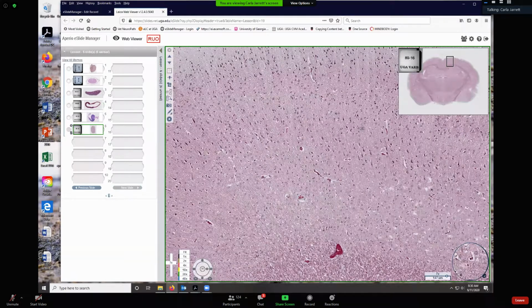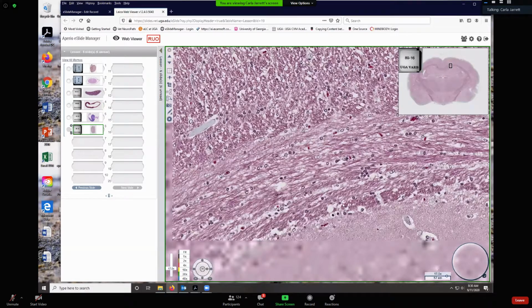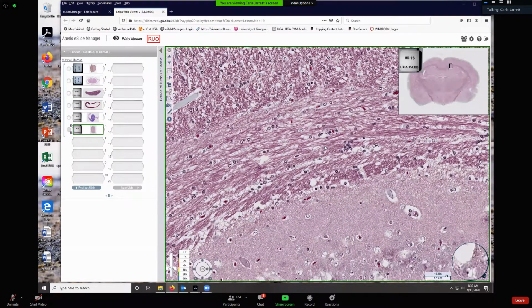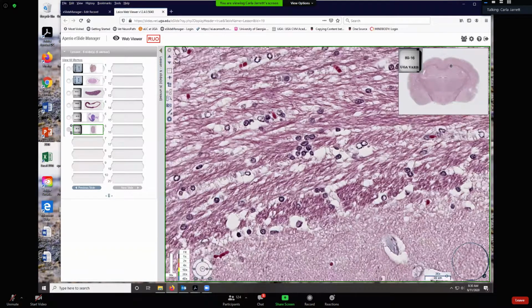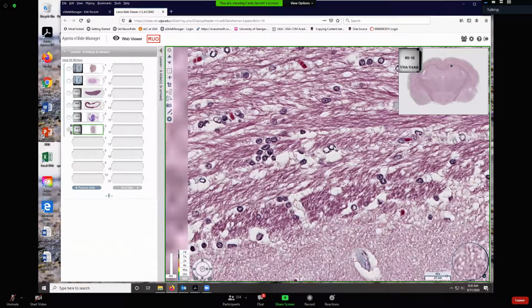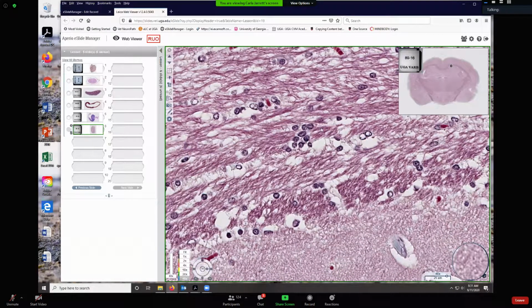Now, if you come down here in the white matter where these oligos are performing a myelination function, you'll see a lot of oligos down here. Here's a whole cluster of oligodendrocyte nuclei. Sometimes I call it blowouts. They kind of have blowouts when we process them, and there's not a lot of nuclear detail there. I just call that a blown out oligos right here. So don't pay any attention to that. That's artifact. Something went wrong with the preservation of that nucleus.